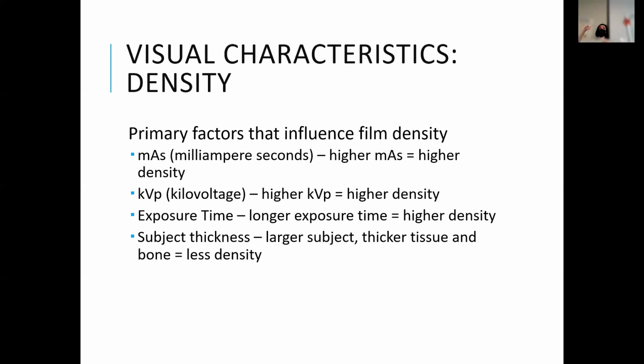The molars get more exposure time, a longer beat, with more X-ray photons coming out of the tube head for a longer period of time than when you set it on anterior, which is a shorter exposure time. Does that make sense? You're changing the time. So longer exposure, more X-ray photons, denser image.